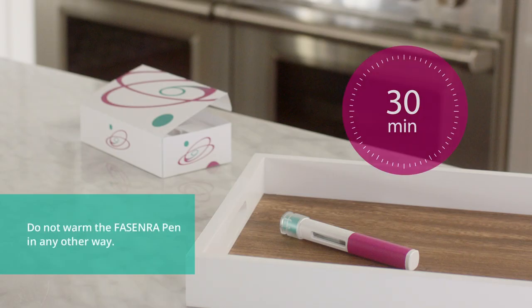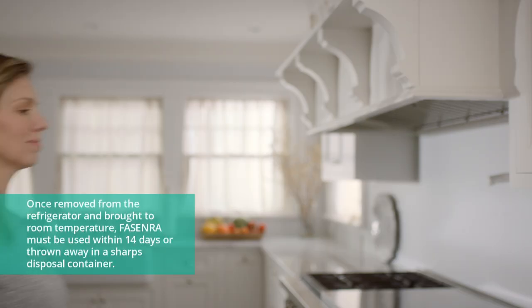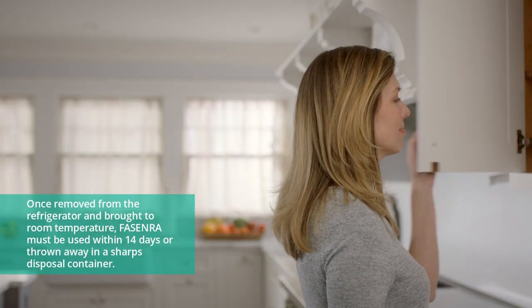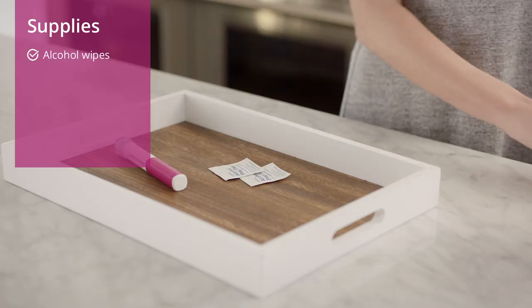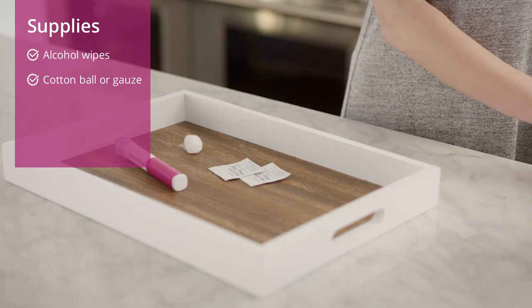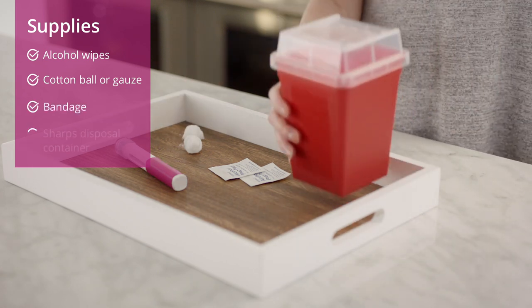Let it warm up at room temperature for 30 minutes. While it warms up, get your supplies. You will need an alcohol wipe, a cotton ball or gauze, a bandage, and a puncture-resistant sharps disposal container.